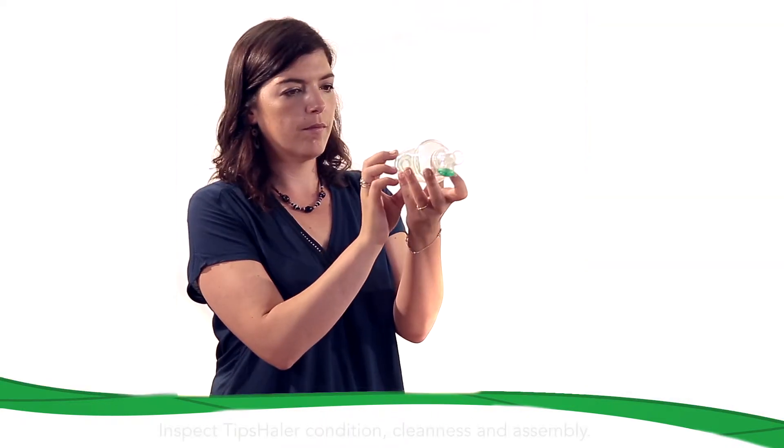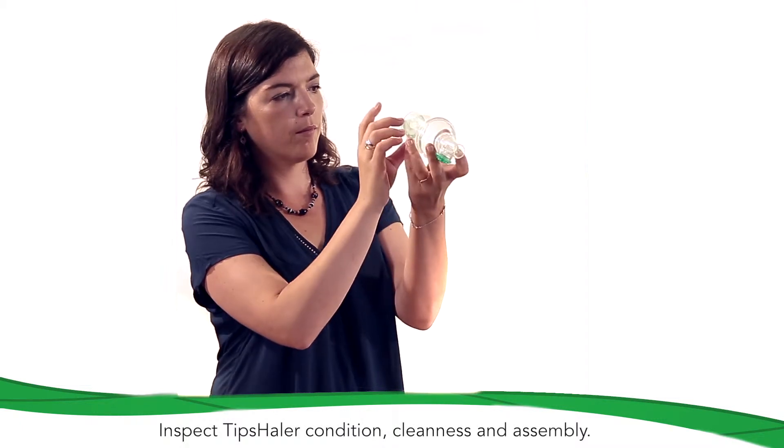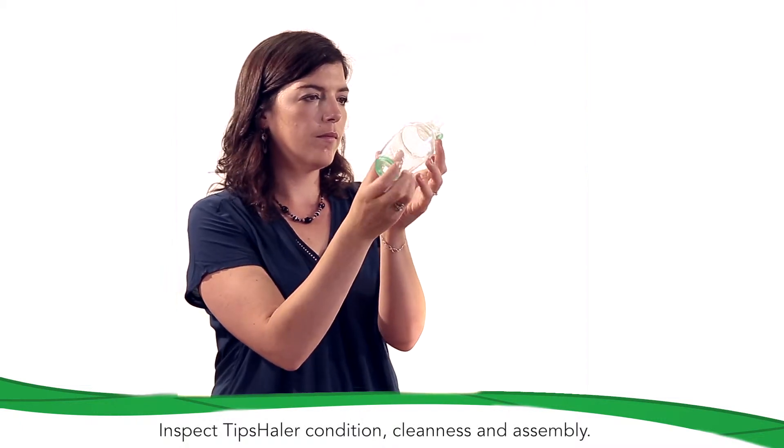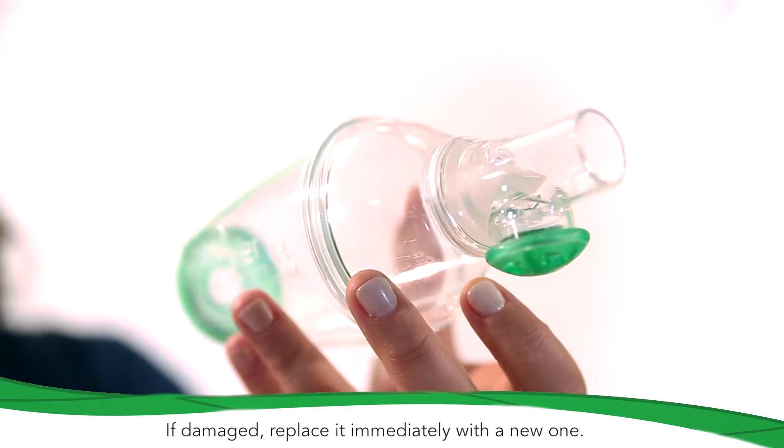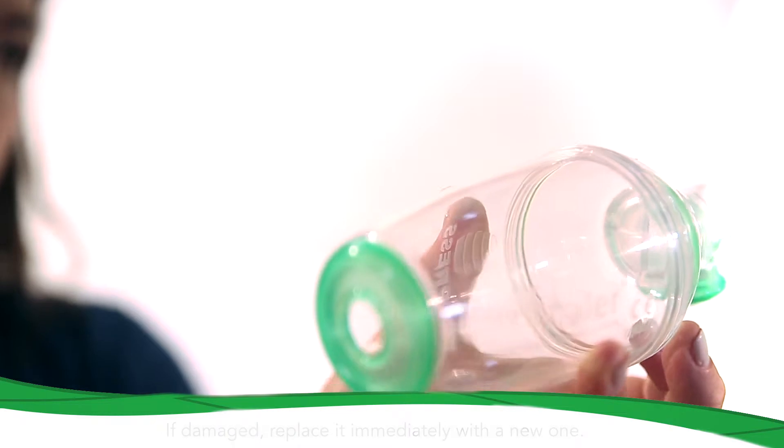Before each use, make sure that Tipshaler is in good condition. Please also check that all parts of the Tipshaler are well connected and don't contain any foreign matter. If damaged, replace it immediately with a new one.